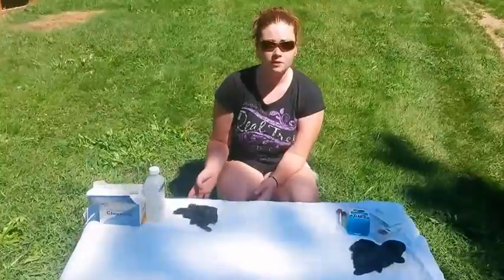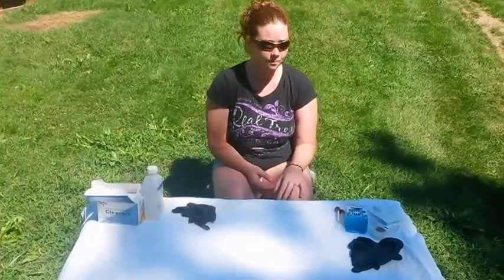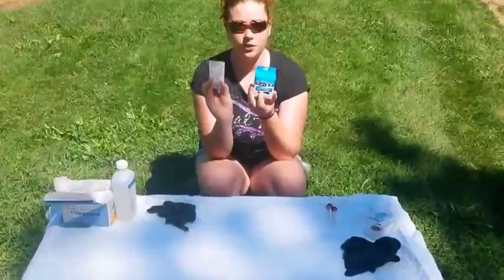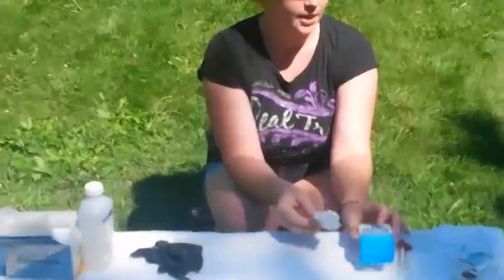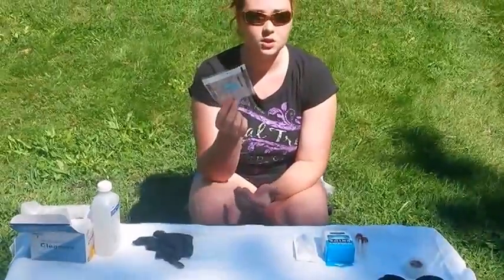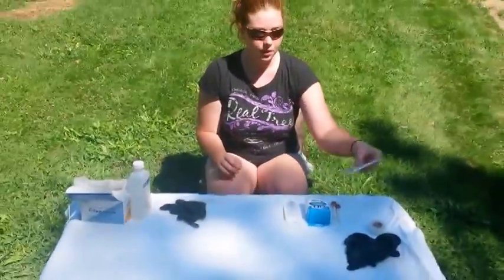I'm going to do one of a large fowl and one of a bantam. You use a needle and a holder for your large fowl. And then on my bantams I use a butterfly needle to draw the blood. It's easier and smaller, as they're a smaller bird.